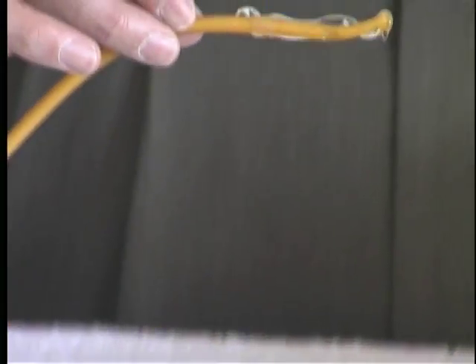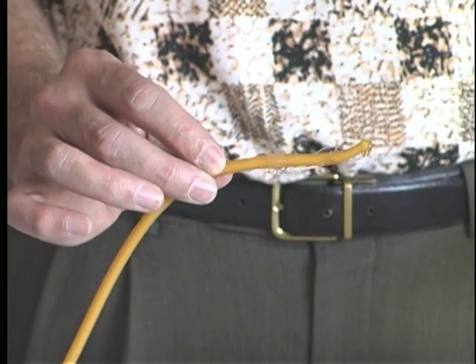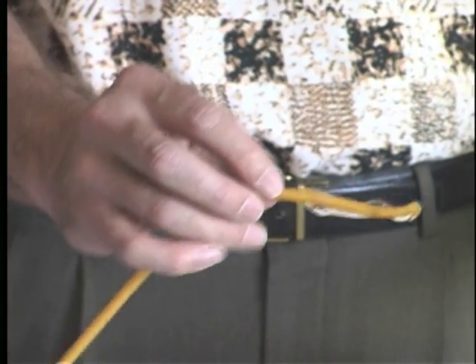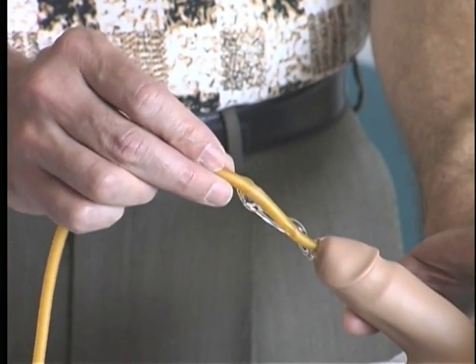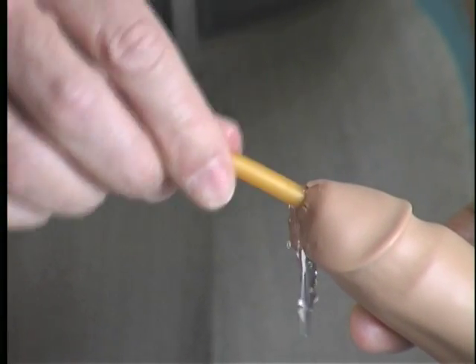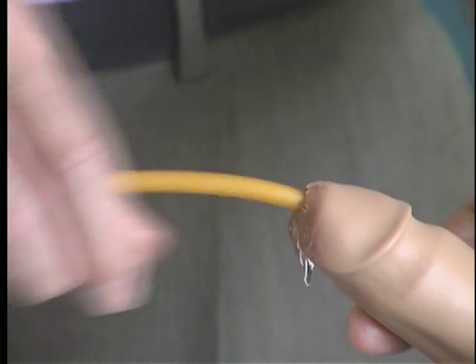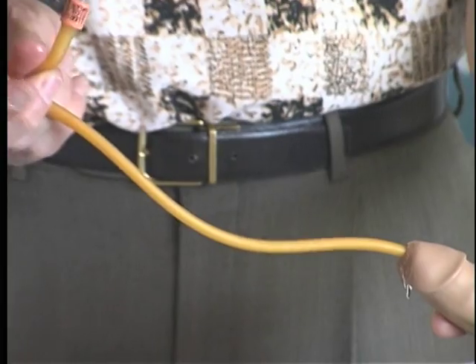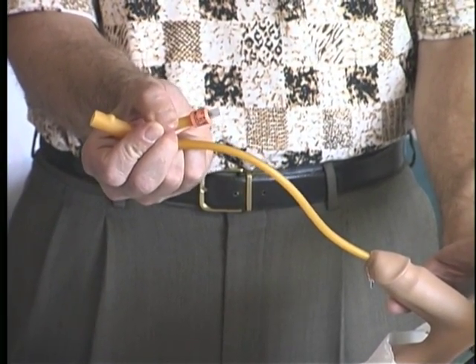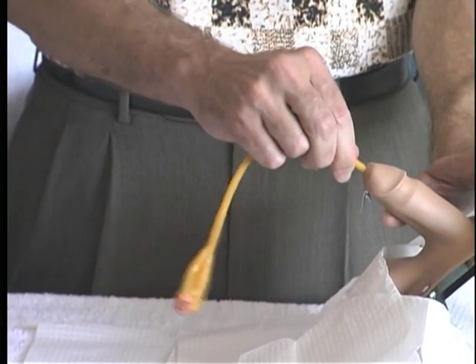The catheter is grasped in a standard manner, and the curve should be noted to be pointing towards the ceiling or the patient's umbilicus. Gentle insertion into the penis allows for passage of the catheter. The lubrication allows for continued passage, making sure at all times that the knob present at the tip of the catheter is pointing towards the ceiling. This tells you that you're in the proper position for continued passage of the catheter.